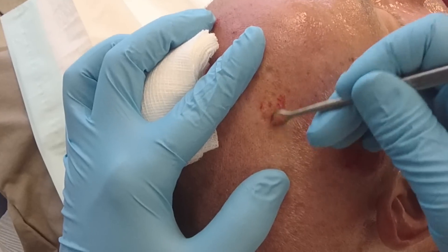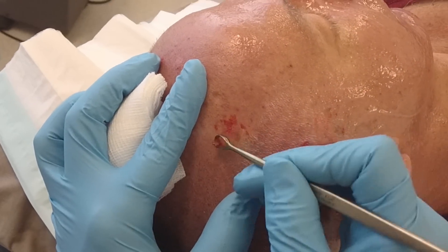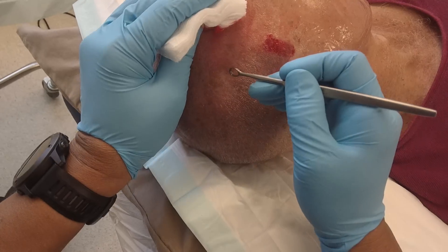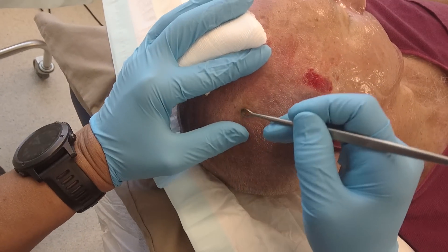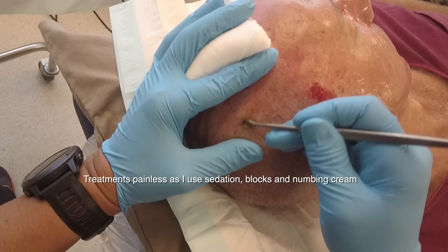It removes the lesion nicely without actually cutting into the skin. It's a very quick and neat procedure. With the curette, we can remove hundreds of these lesions in a few minutes.